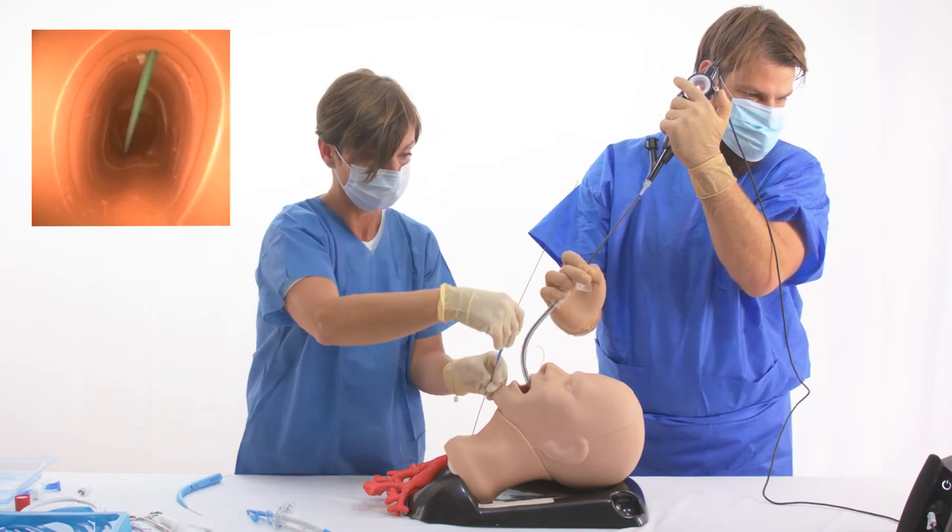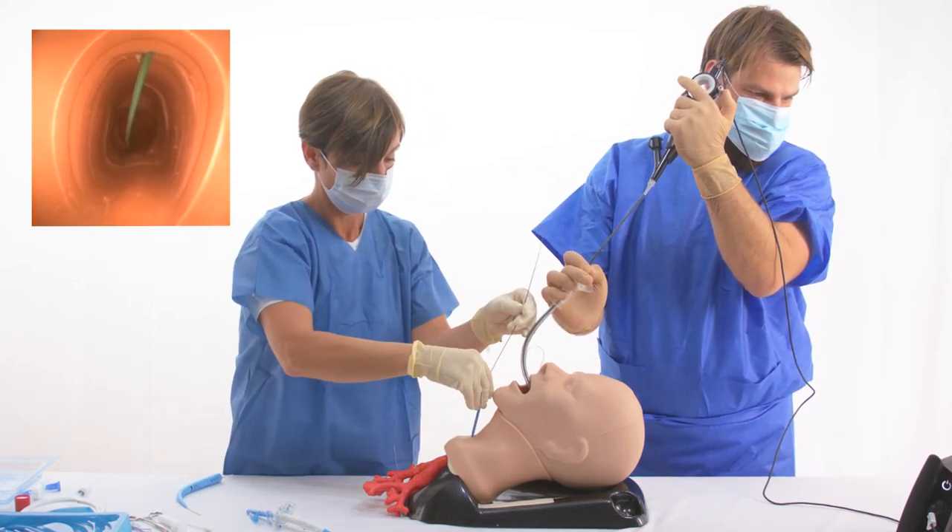The short introducer dilator is advanced and then removed over the wire guide.